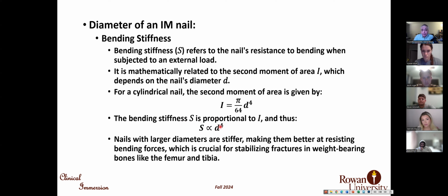If you remove 3 millimeters of the material inside it, if you remove a rod with 3 millimeter diameter from inside this and make it a hollow rod, you removed 81 of the distribution of the material from inside. So the material that is remaining still has 256 minus 81. Still, it is a high proportion for bending stiffness.